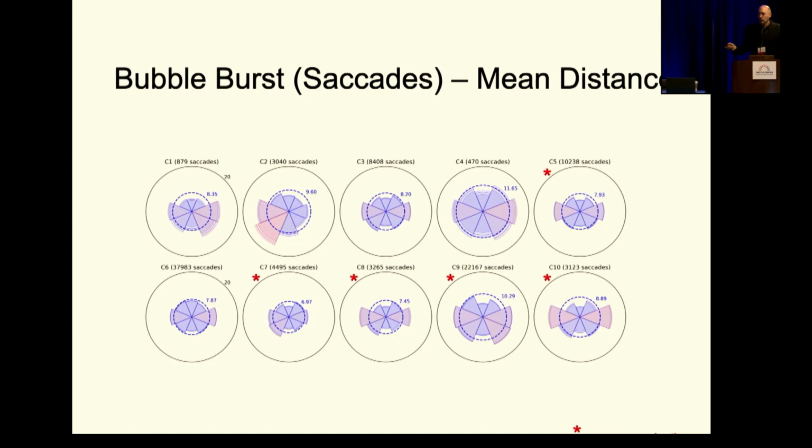We can calculate and analyze the saccades not just by where you're looking, but the distance over which you look, and the same sort of thing. You can have the normal kind of patterns that you see, and you can have atypical patterns, and those atypical patterns are quantifiable. So we set out a set of metrics that are not only quantifiable, but that a non-expert can look at quickly and see where there's a change.